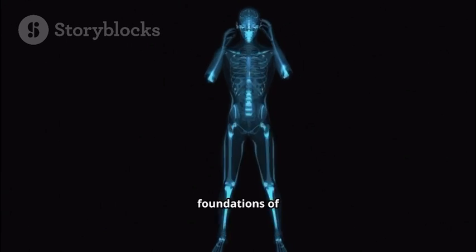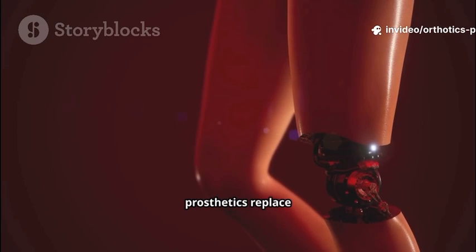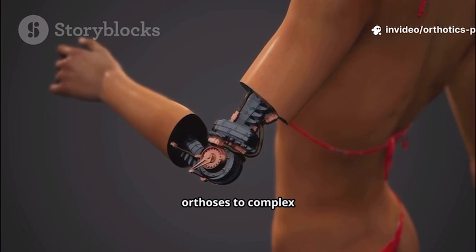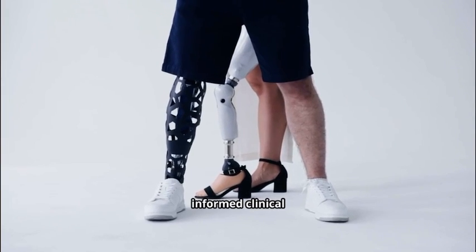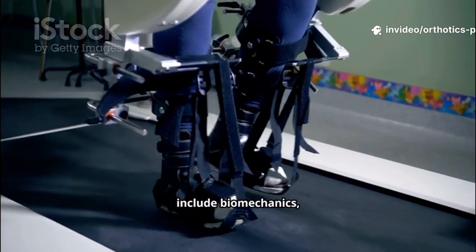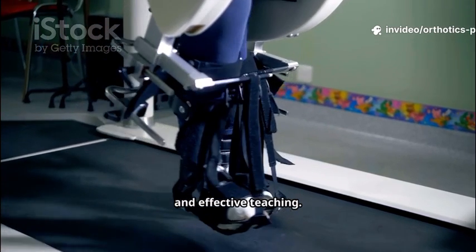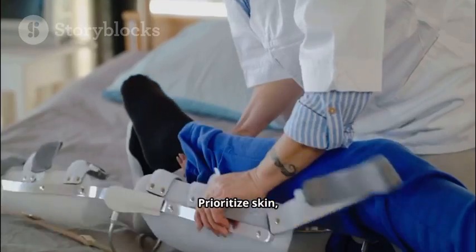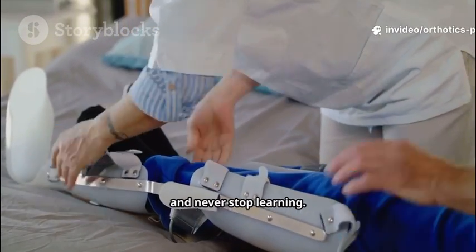We journeyed through the foundations of orthotics and prosthetics. Orthotics support the body. Prosthetics replace a missing part. We explored device types, from foot orthoses to complex myoelectric arms. Understanding variety supports informed clinical decisions and collaboration. Essential skills include biomechanics, thorough assessment, clear communication, and effective teaching. Great therapists blend objective analysis with patient feedback. Prioritize skin, progress gradually, focus on personal goals, and never stop learning.